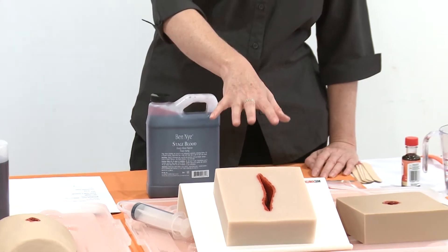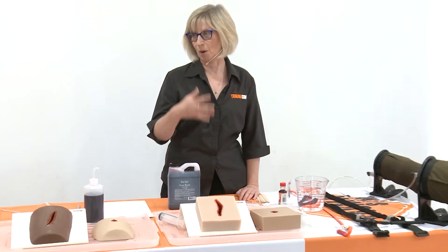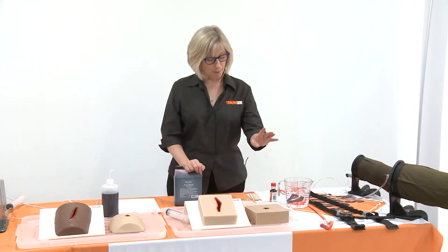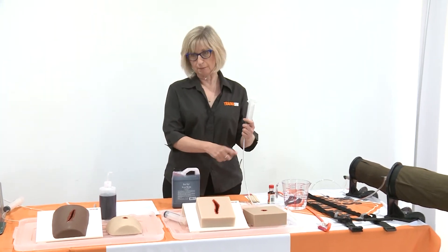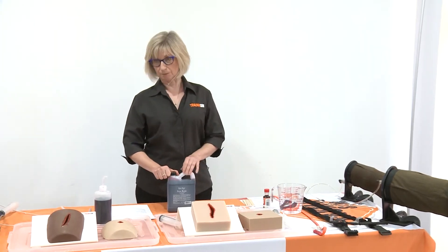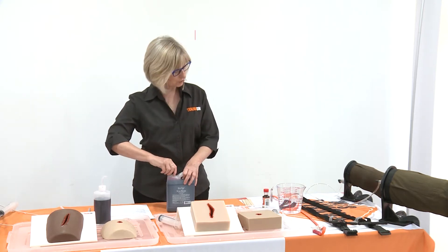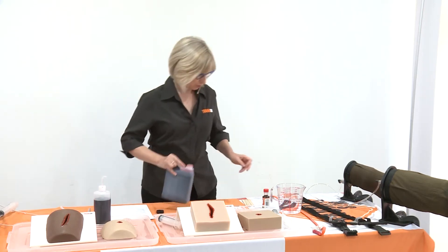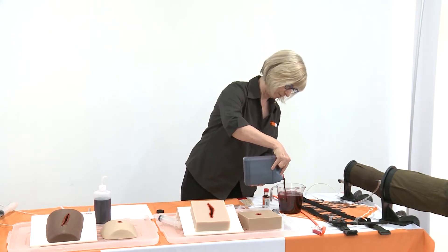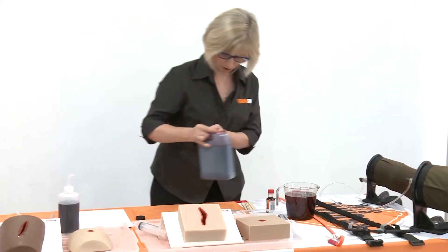It's safe to go on your skin and safe to go in your mouth. We also use this in our moulage where we might do facial injuries and so forth, so it's very safe to use. Because we're going to run it through some tubing, we need to dilute it a little bit — normally one part blood to four or five parts water. I'm just going to pour some into our jug here — that's a rough measurement but you get the general idea.